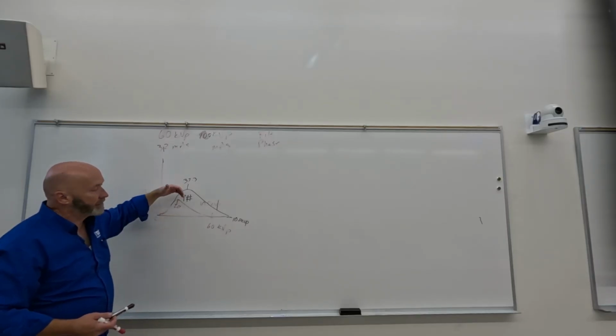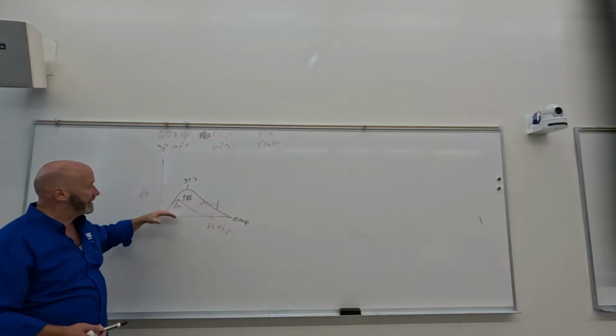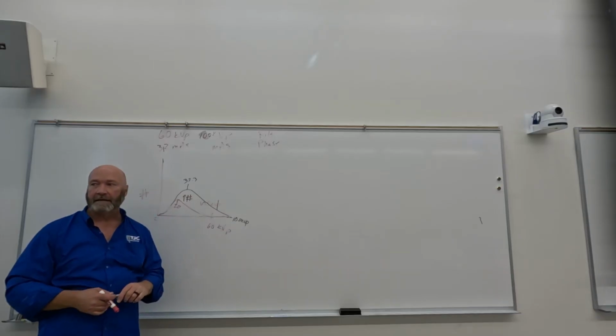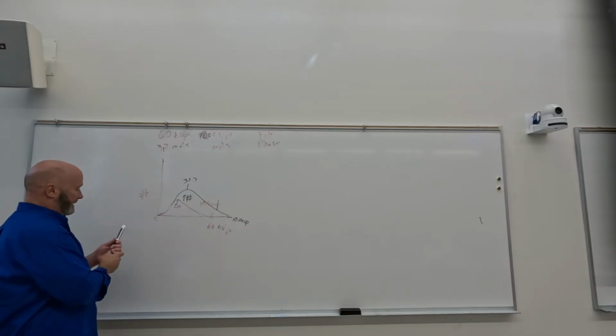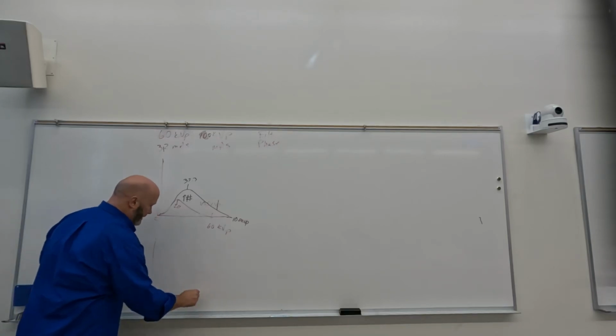You get an increase in numbers. You get an increase in peak energy. You get an increase in average. It pushes the bremsstrahlung spectrum towards the high energy side. Okay, so that's kVp. With mAs, let's do the same thing with mAs.